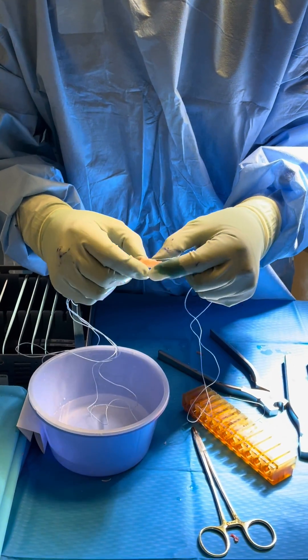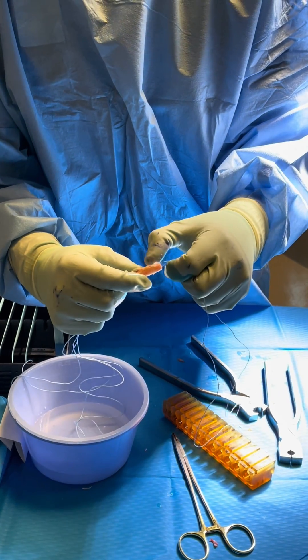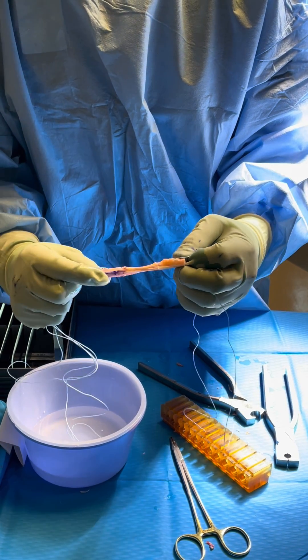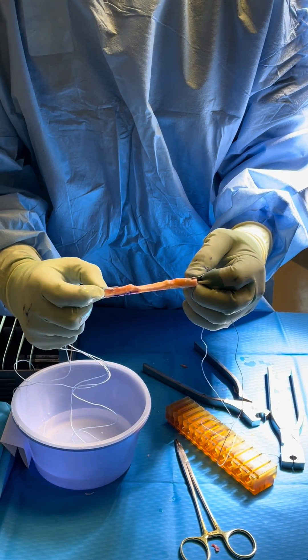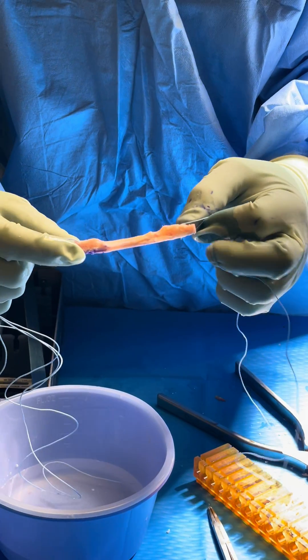There's a smaller piece of bone off the patella. This is a suture that we use to guide it into the tunnel, and once we fixate the graft on the femoral side, we pull tension here. These are two bigger sutures on the tibial side to pull tension on the graft so that we can fix it under tension.